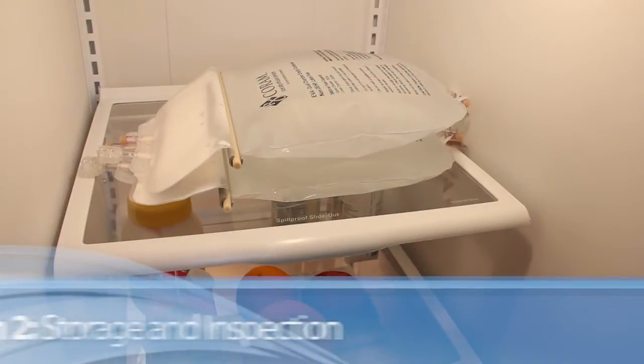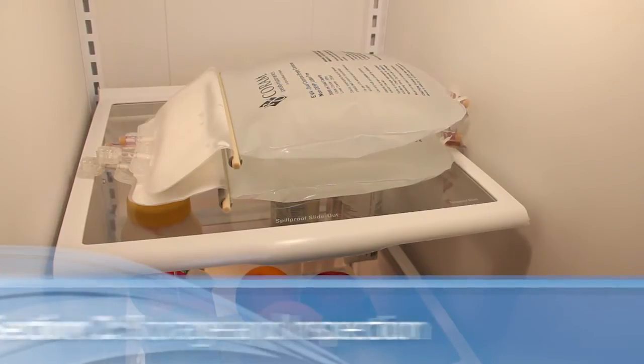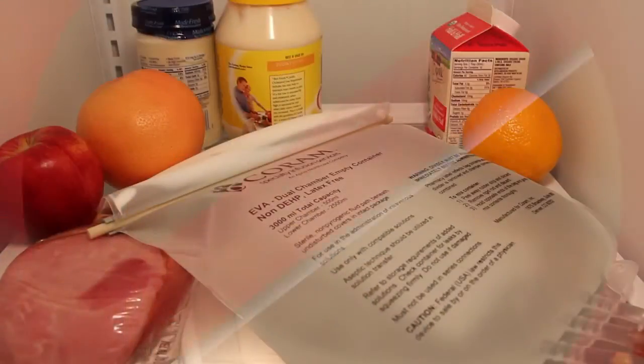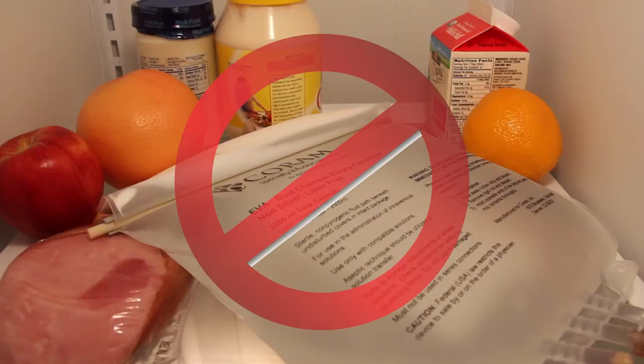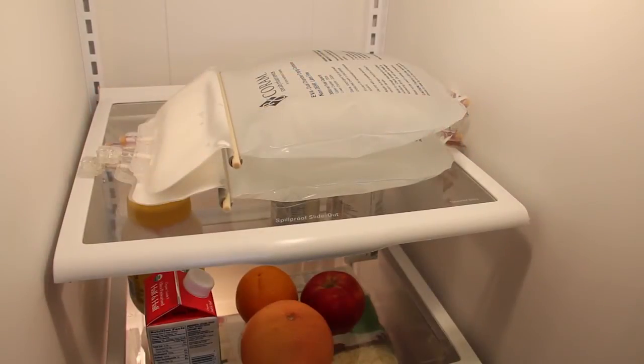Refrigerate your shipment of TPN as soon as you receive it. Do not stack more than three bags on top of each other in your refrigerator. Your TPN should be stored on an upper shelf that has been well cleaned, and no other food should be stored on the shelf. Be careful not to handle the TPN bag dividers until you are ready to use the bag.